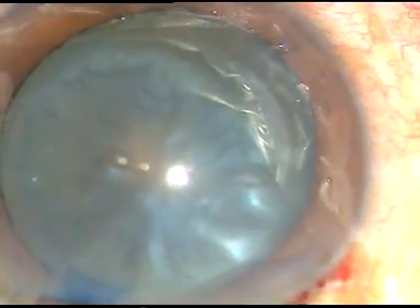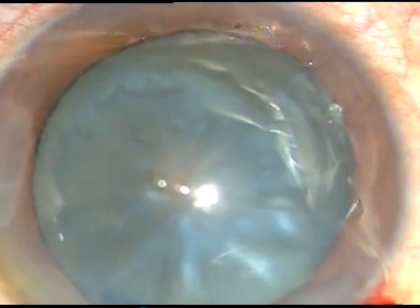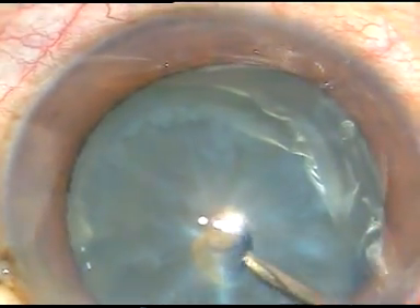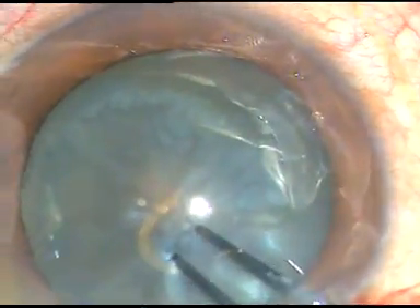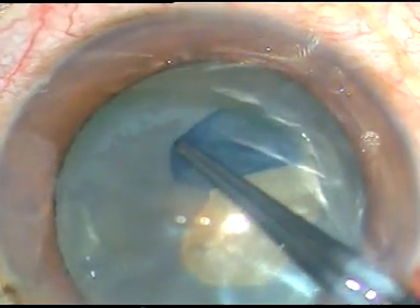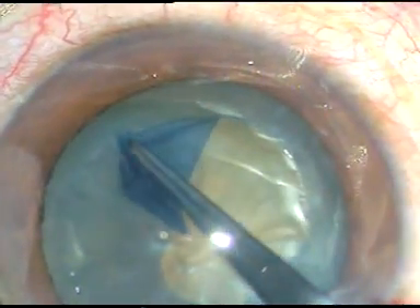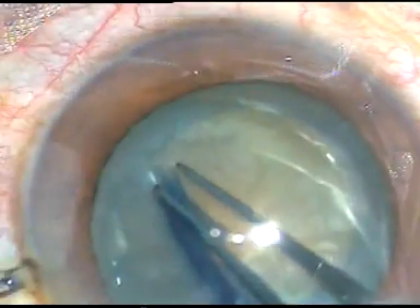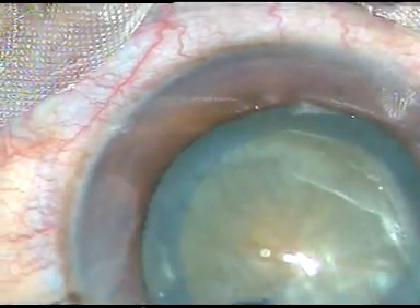Now I have to do capsulorhexis. I take a bent needle, go through the main incision, and incise the capsule and raise a flap like this. Now I hold this capsular tag with Utrata forceps, go anticlockwise, and I try to remain at equal distance all around from the margin of the dilated pupil.